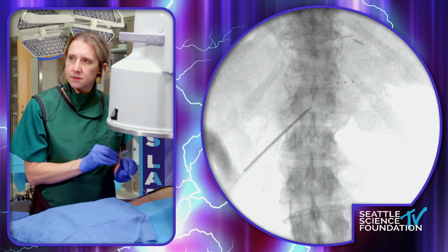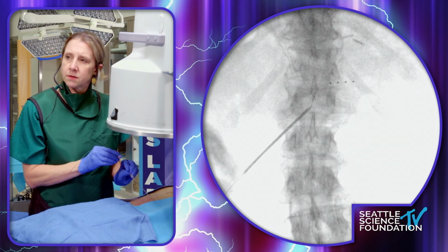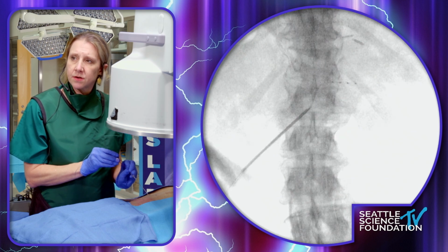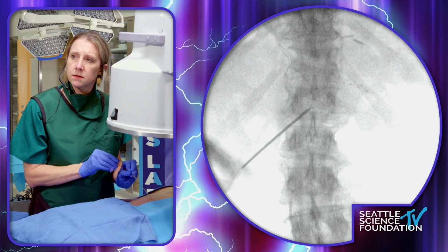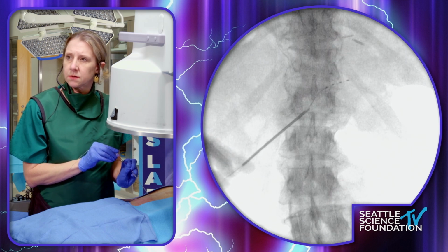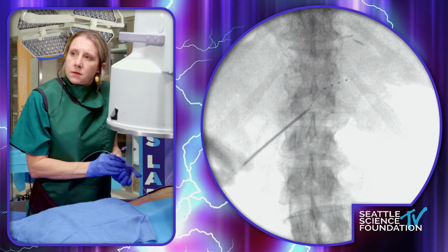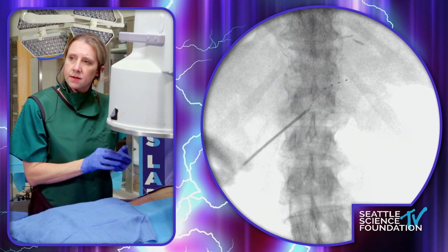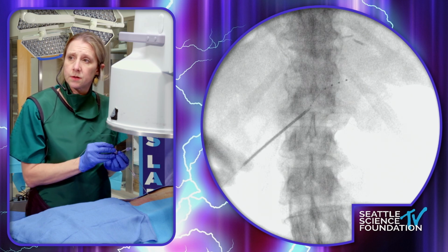So, troubleshooting the situation. Picture. What I think I'll do is just turn my catheter toward the same side, which is certainly not producing the effect I want. Stop, please. All right, and then the next thing I could do would be to advance the lead alone.